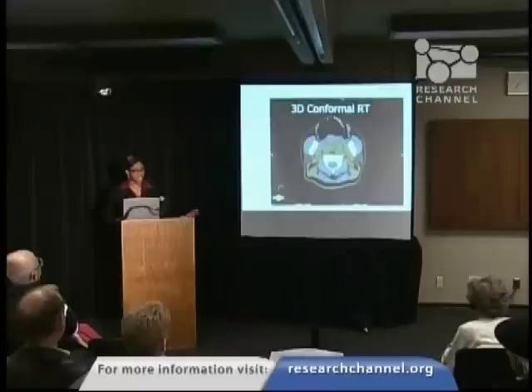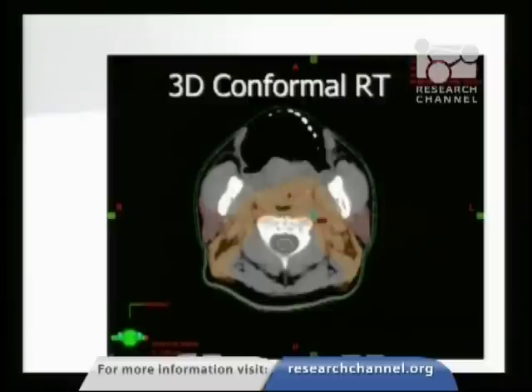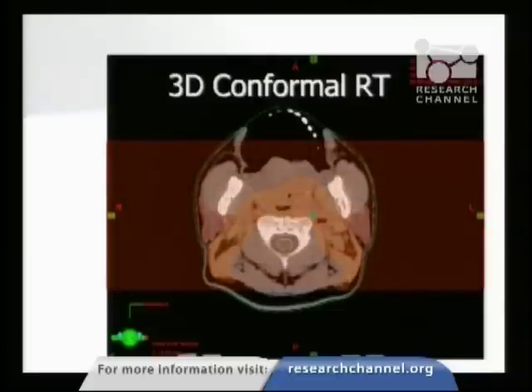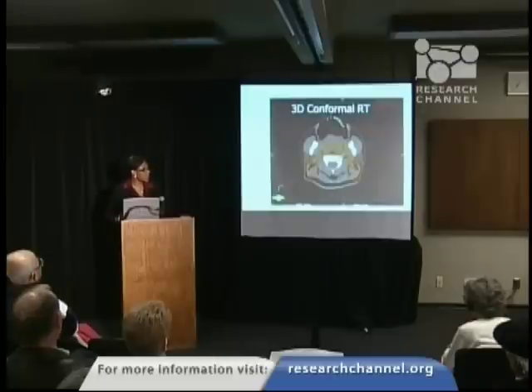With three-dimensional conformal radiation, this is just a slice on a CT scan through the neck region near the teeth. This is the tongue, this is the spine, and we've outlined an area at risk for tumor in orange, with the actual tumor cells outlined in red. These are the parotid glands that produce saliva, which we want to protect. However, with 3D conformal or two-dimensional treatment using very simple radiation fields, it essentially irradiates this entire area almost homogeneously, giving a fair amount of dose to the salivary glands.